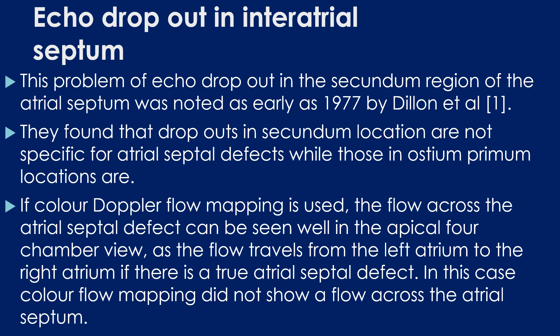If colour Doppler flow imaging is used, the flow across the atrial septal defect can be seen well in the apical 4-chamber view, as the flow travels from the left atrium to the right atrium if there is a true atrial septal defect. In this case, colour flow mapping did not show a flow across the atrial septum.